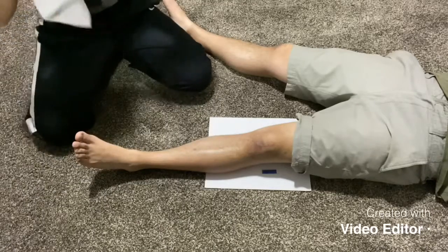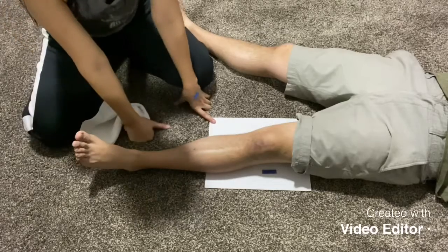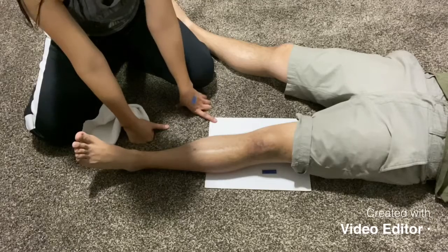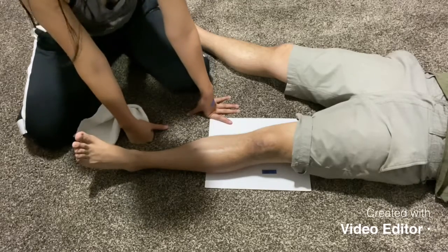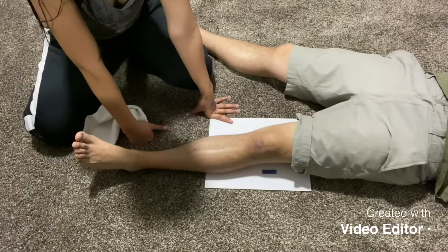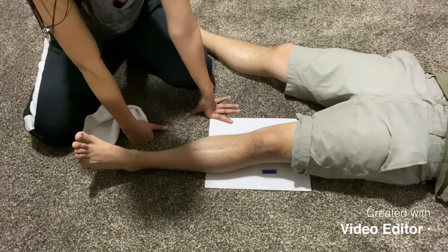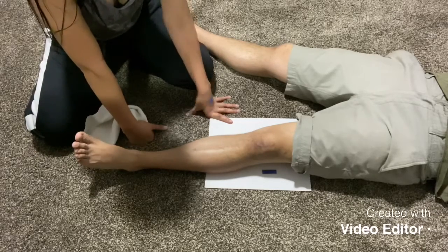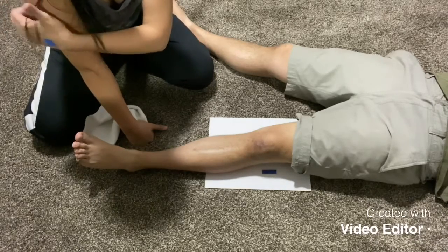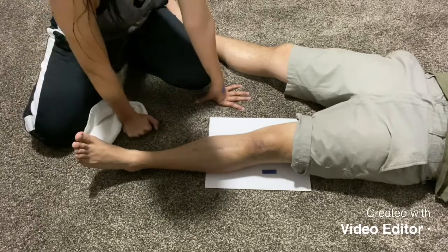Okay, for the next exam, I'm going to do a medial oblique. Again, I'm going to use a 10x12 inch cassette with a 40-inch SID tabletop. The angulation on this exam is going to be the same as it was for the AP knee. Being that if the pelvis on the patient is less than 19 centimeters, then you're going to angle the tube 3 to 5 degrees caudad. If it is between 19 and 24 centimeters, then you're not going to angle the tube. And if it's greater than 24 centimeters, then you're going to angle the tube 3 to 5 degrees cephalad.